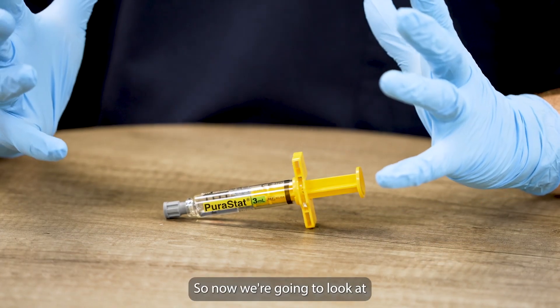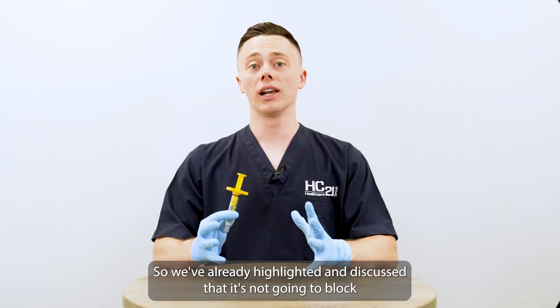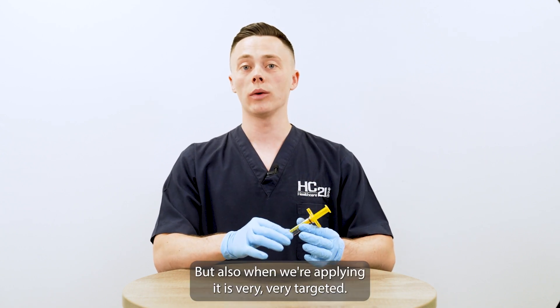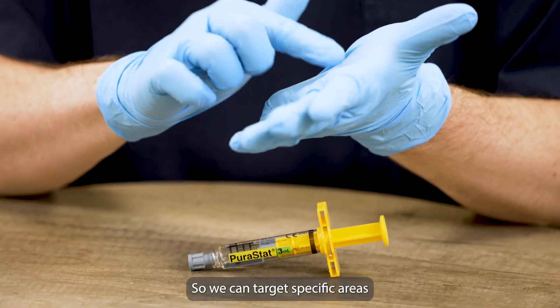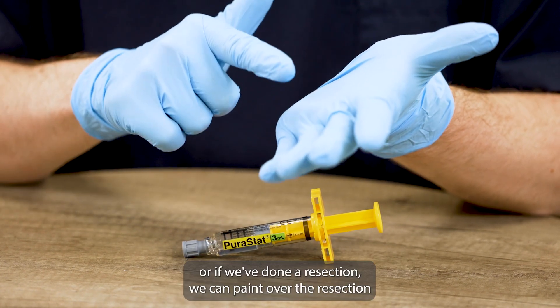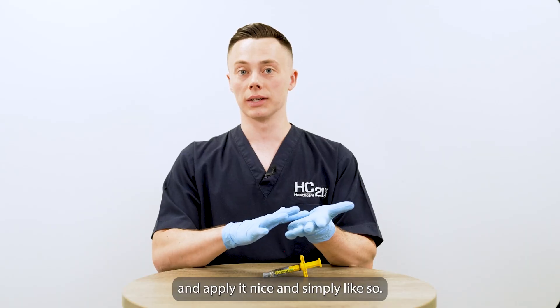So now we're going to look at the targeted approach of PuraStat, which is one of its key benefits. We've already highlighted that it's not going to block or obscure our view in any way, which is fantastic. But also when we're applying it, it is very, very targeted. We can target specific areas if there's a specific point of bleed on a lesion, or if we've done a resection, we can paint over the resection and apply it nice and simply.